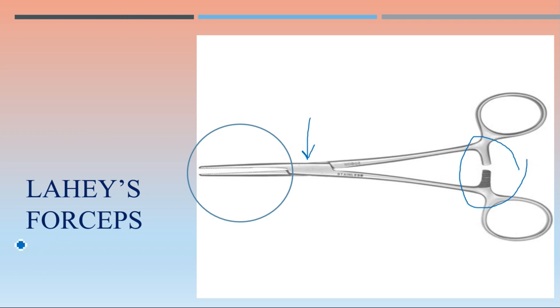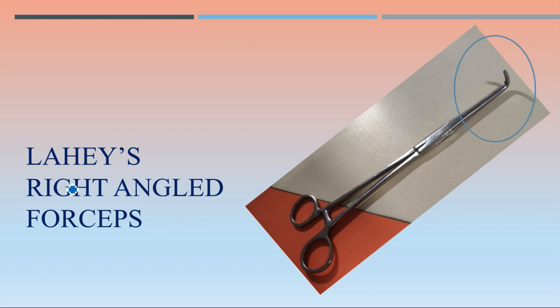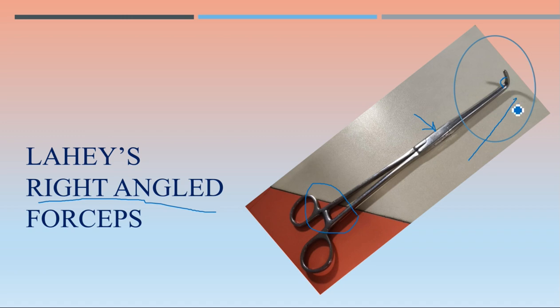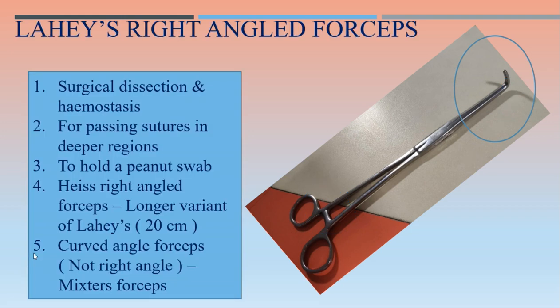The large-size artery forceps is Lahey's forceps. Then Lahey's right-angled forceps — the word 'right-angled' is important. You can see the presence of a lock, the joint, the long distal portion, and the angle is 90 degrees. This is Lahey's right-angled forceps — just try to identify the instruments first.